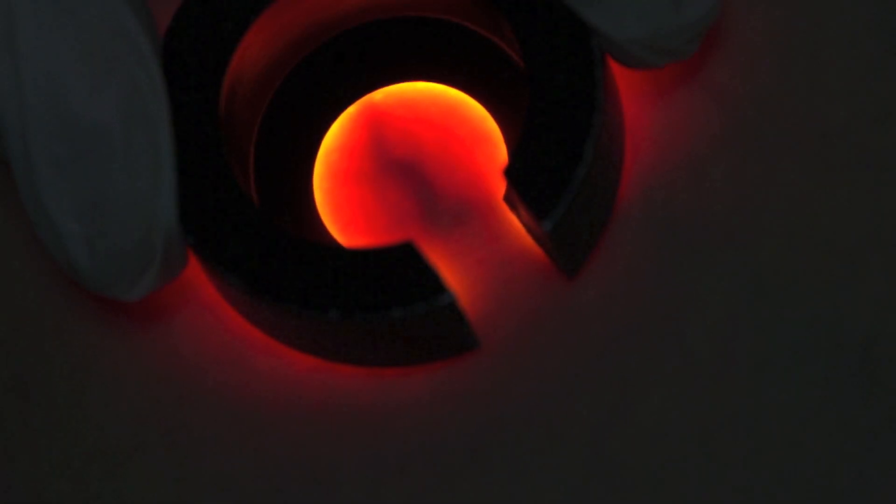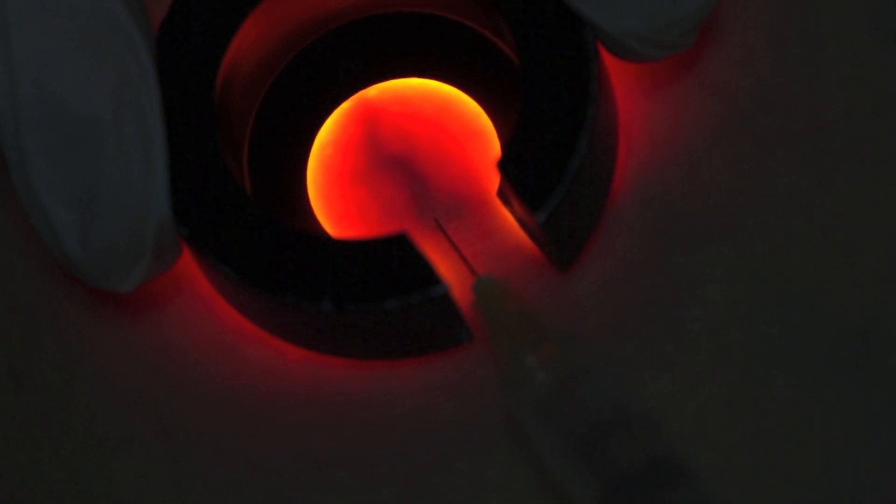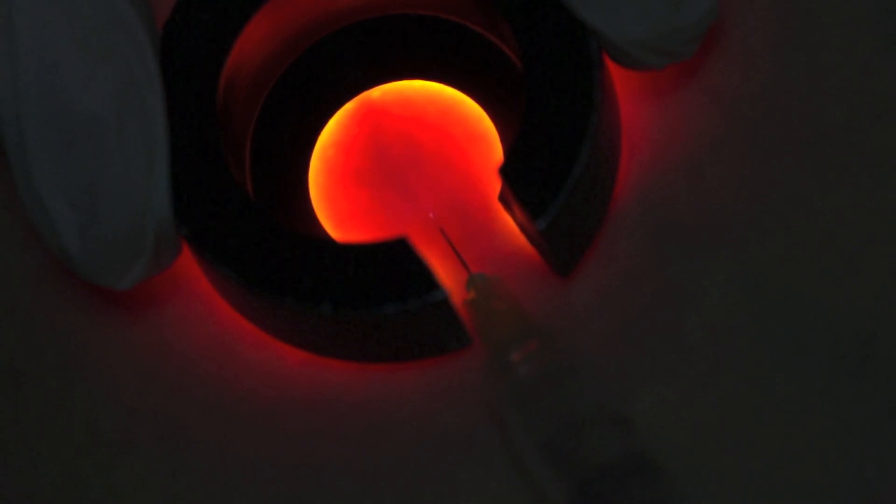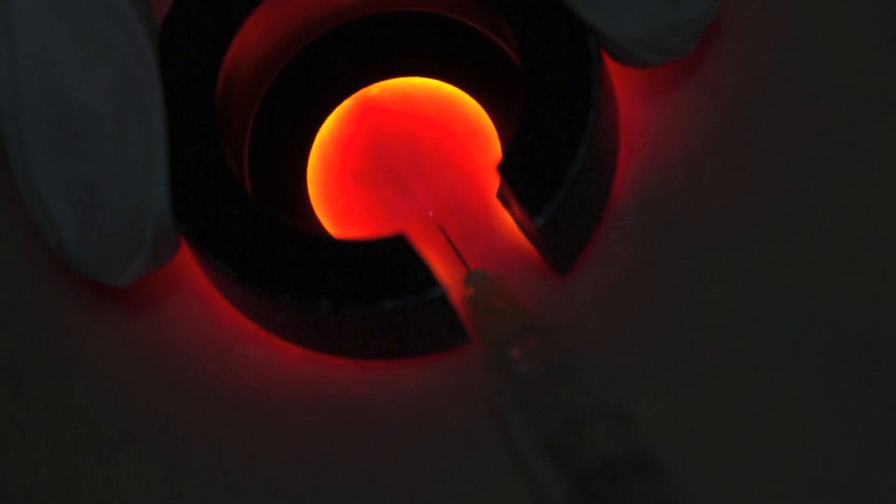Let me show you how the vein light system is used to inject reticular veins. The application of the vein light to the skin demonstrates the reticular vein as a dark silhouette. The gap in the vein light ring allows the introduction of the needle and syringe containing the sclerosant.